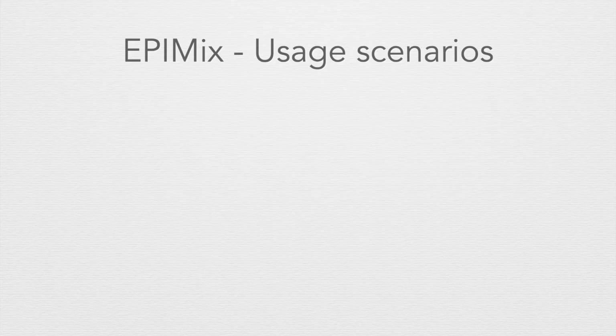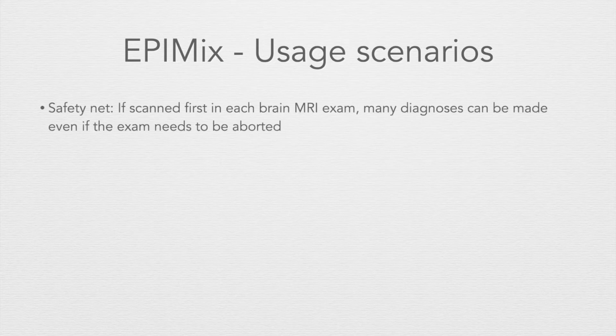But for EPIMix now, there are some use scenarios we see. First, and this is also the way we have used it at our department, at the hospital, we have used it as a safety net. So if we scan it first in each brain exam, many diagnoses can be made even if the exam needs to be aborted. And we have had quite a few cases, not every week, but say once a month or so, where the patient has either crawled out of the scanner or been screaming and wanted to get out of there. And we're talking adults in this case.